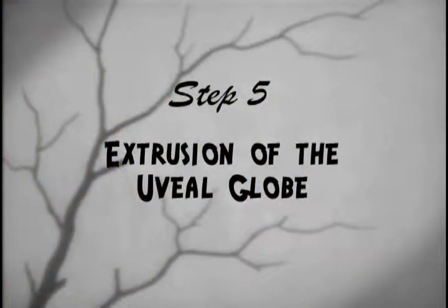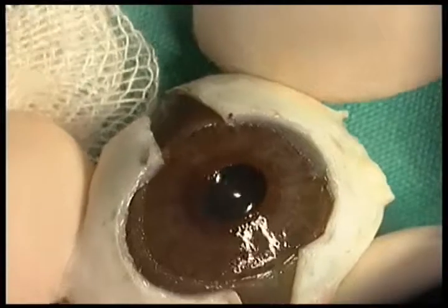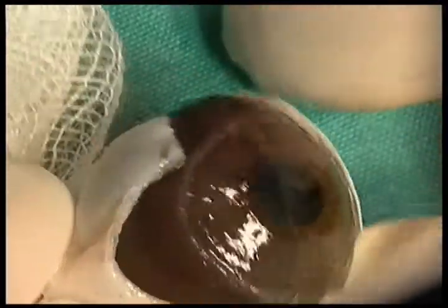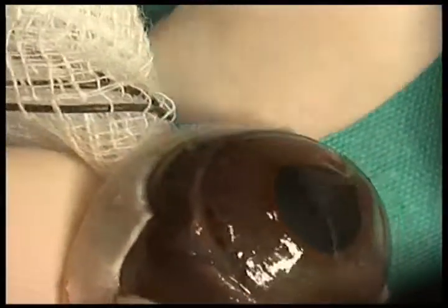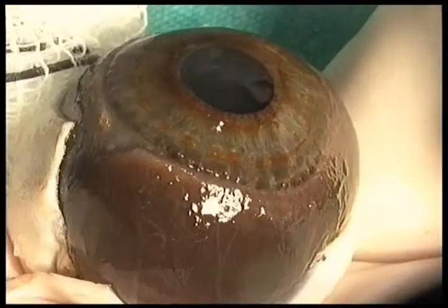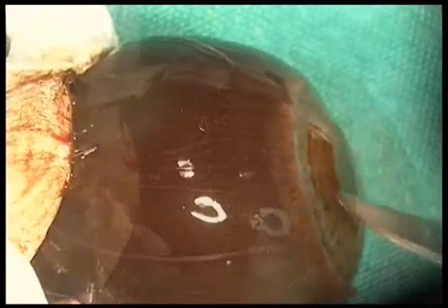Step 5. Extrusion maneuver, from Latin extrudere, to give form to a mass by passing it through a specially formed opening. For that, we apply pressure to the whole circumference of the donor sclera to extract the contents of the ocular globe in its entirety, better said, choroidal globe.